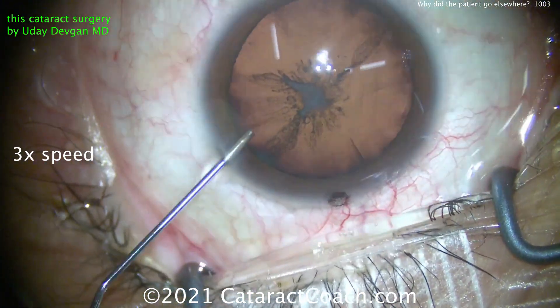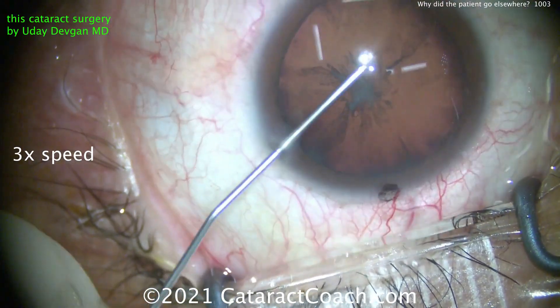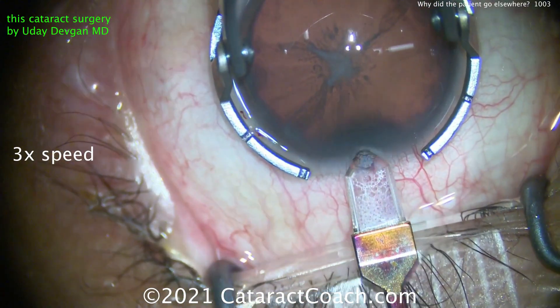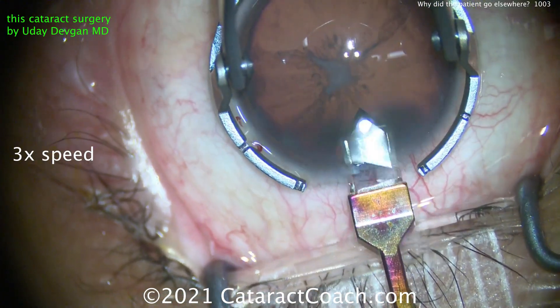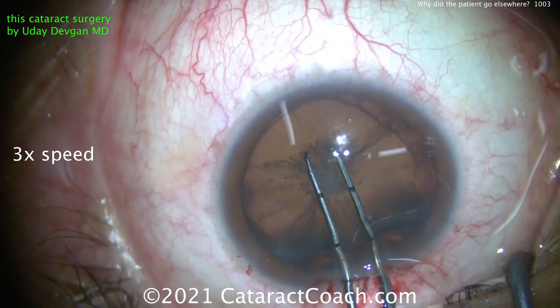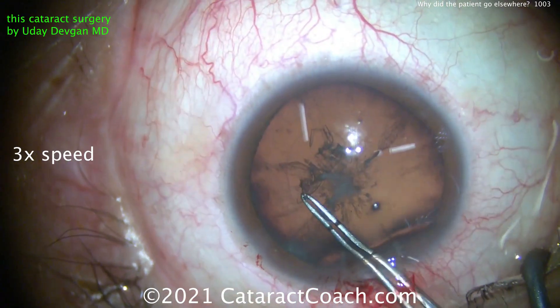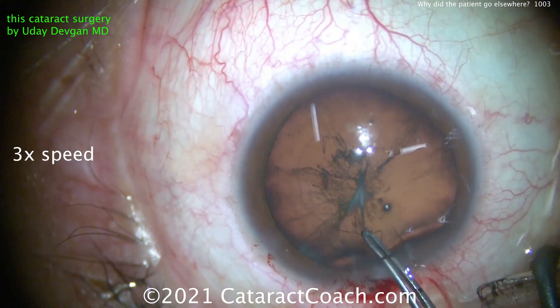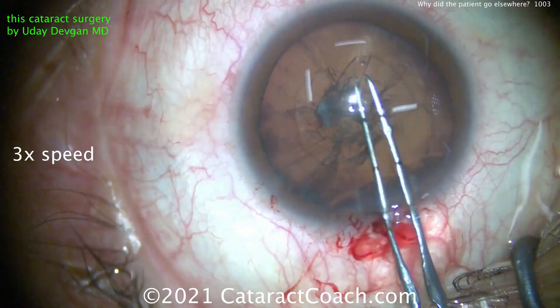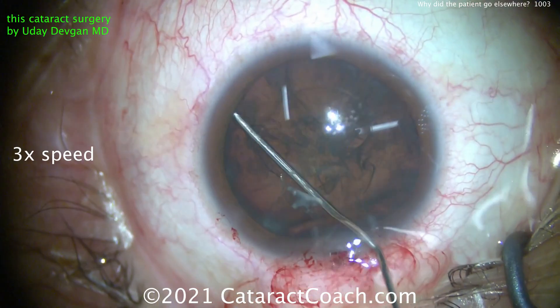Here's the original cataract surgery. I performed the surgery a few months prior to the patient seeing another doctor, and you can see there's an anterior cortical cataract. I'm sitting here superiorly and making the incision at 90 degrees. I don't like to operate superior — I like temporal — but I'm doing this because the patient has about 0.65 diopters of astigmatism with the rule.